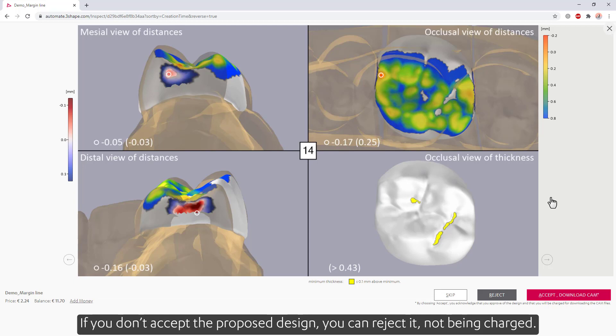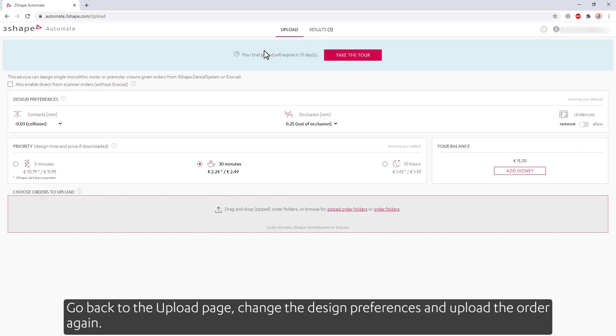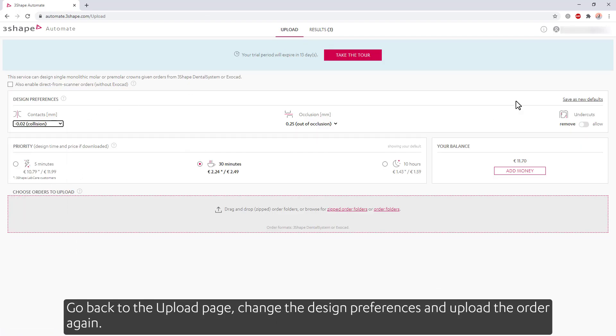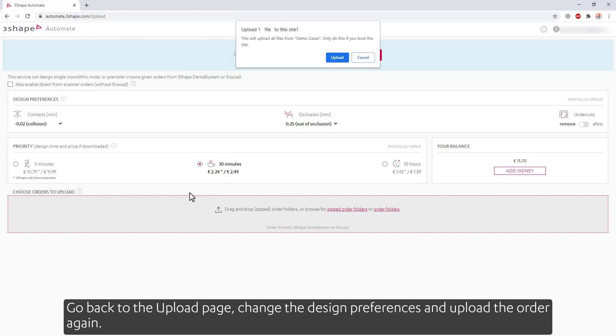If you don't accept the proposed design, you can reject it without being charged. Go back to the upload page, change the design preferences, and upload the order again.